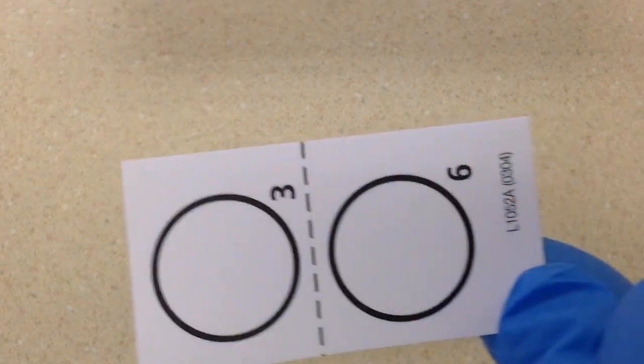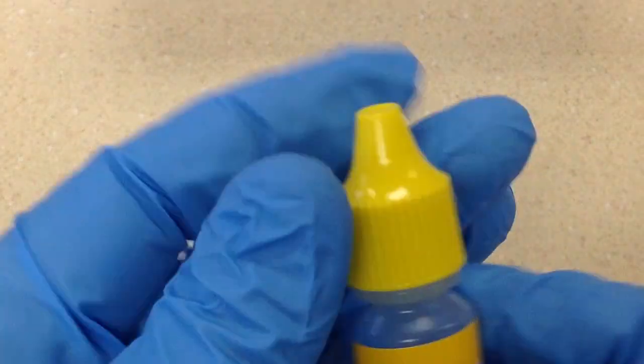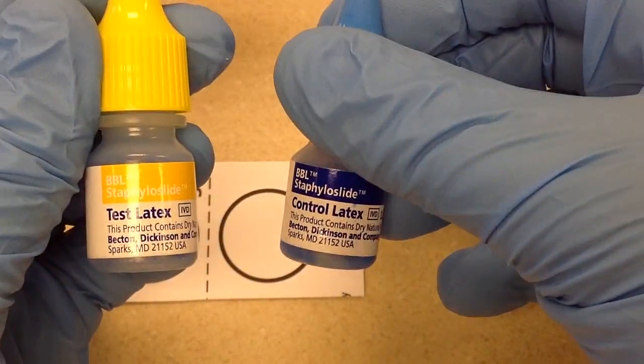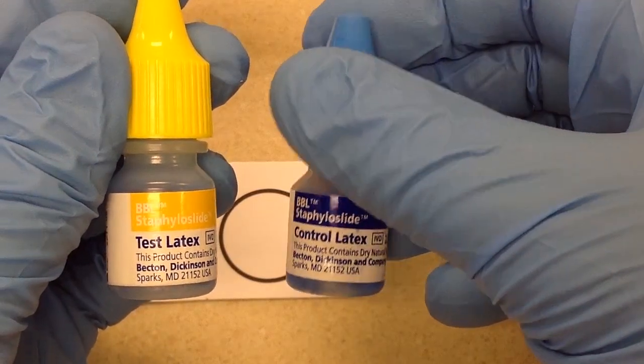In this kit, it comes with these reading cards, and it also comes with the reagents. The two reagent bottles are the test latex, which contains the active reagent, and the control latex, which is basically the latex without the reagent.